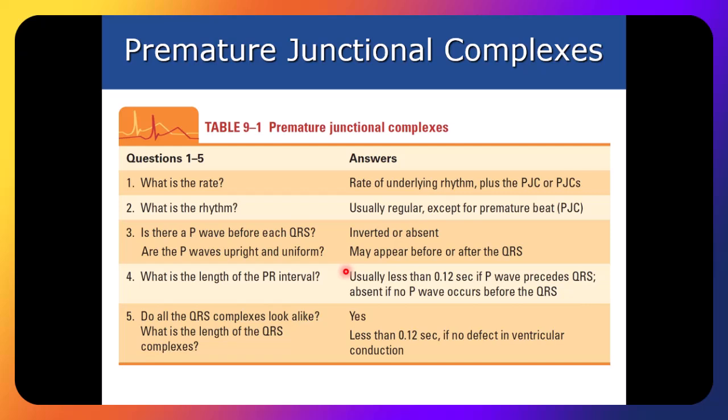The rhythm will almost always be regular except for the PJC because it's going to be earlier. And if there is a compensatory pause, that's going to throw the rhythm off as well.